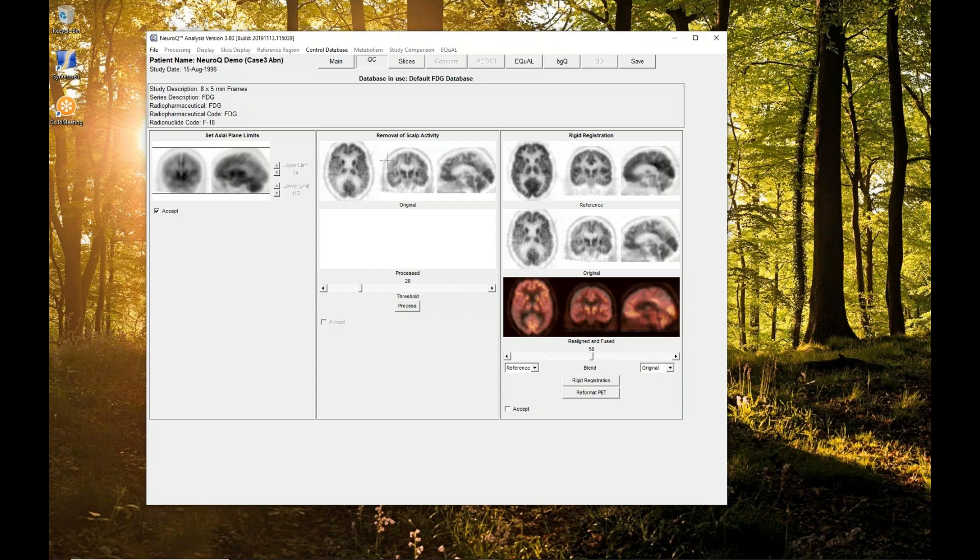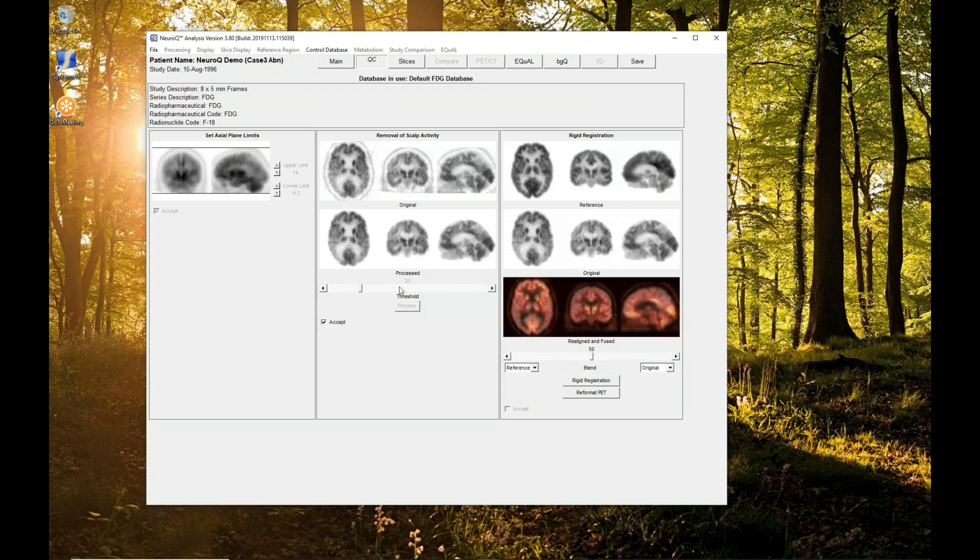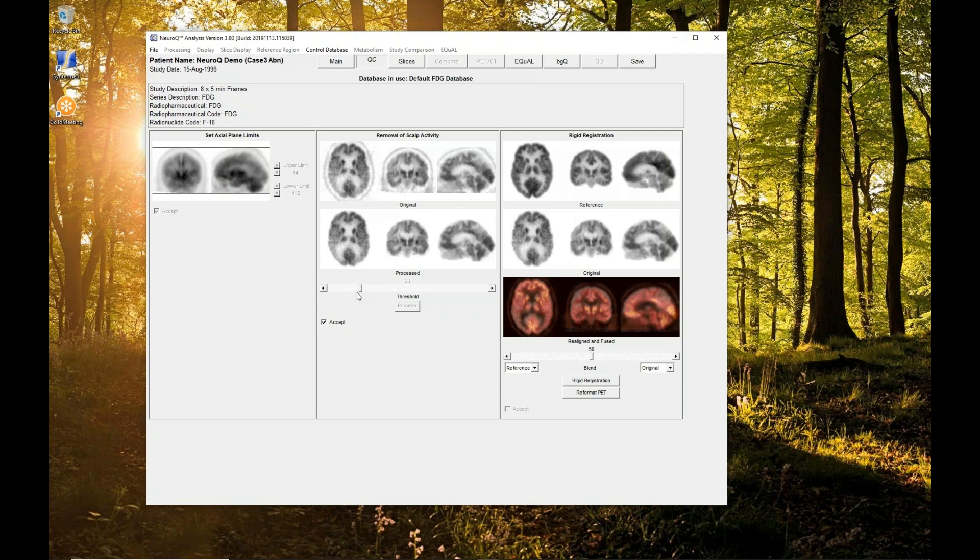The next thing you want to do is remove the scalp. That's a thresholding procedure, as well as some other additional procedures that go into that thresholding. The default is 20%, which works pretty well for most FDG scans. You just click process, and it does that and applies the threshold. When it's done, you'll see the processed image, and then it will replace the processed image on the right. This is kind of okay, where we get a little bit of background activity. What you really don't want is for it to start eating into the brain. If the threshold is too high and it starts eating into the brain and removing brain tissue, that's when you might want to change the threshold.